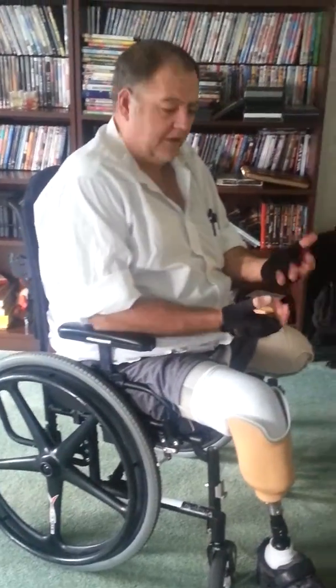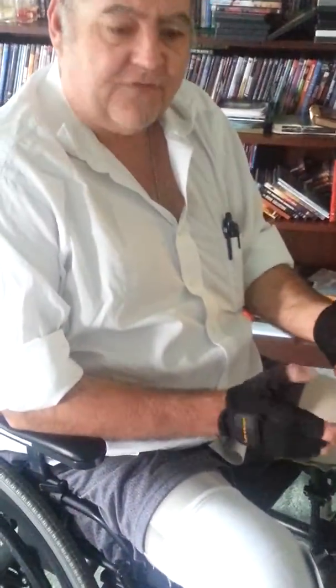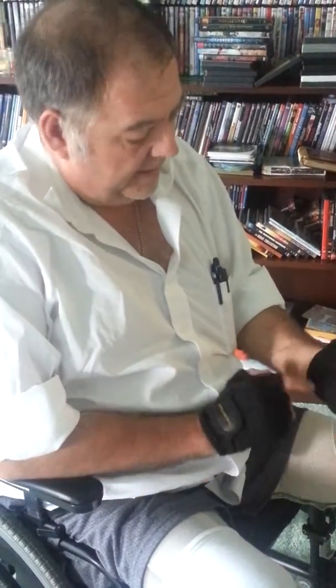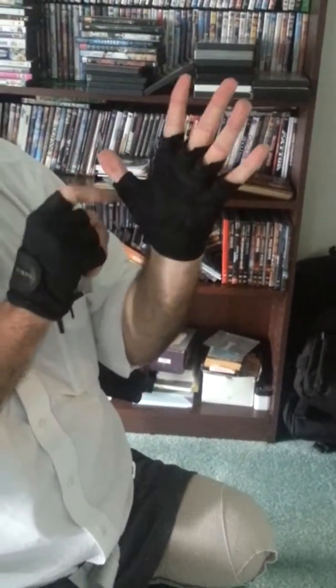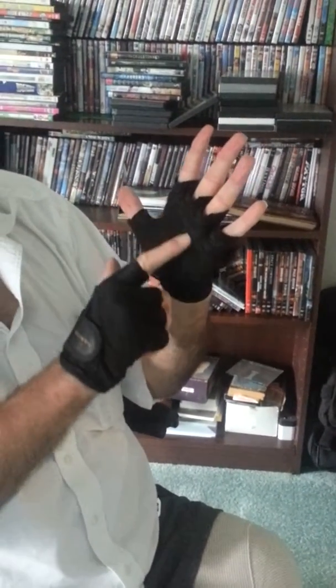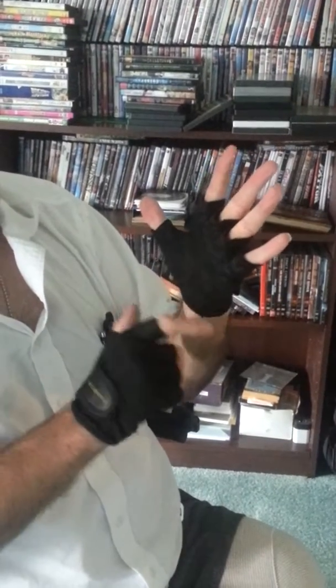What I look for in gloves is leather gloves, and as far as I can tell, anybody who uses gloves is looking for leather gloves. They want gloves that have some kind of extra liner. You probably can't tell because it's black, but this has an extra piece of leather right across here. A lot of work gloves are like that, and I know a lot of people use work gloves on their wheelchair.